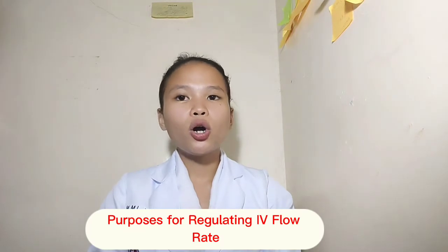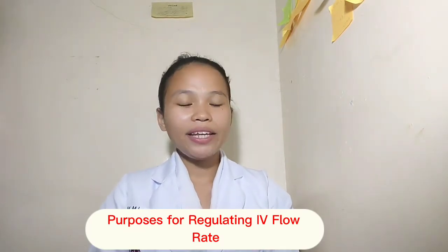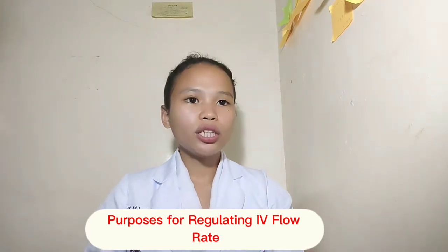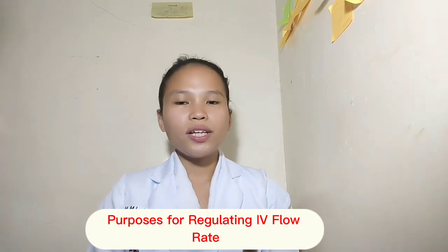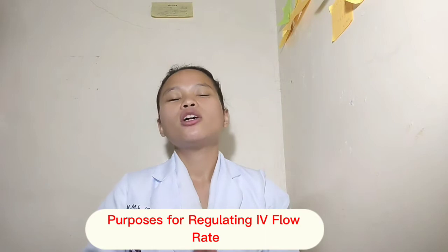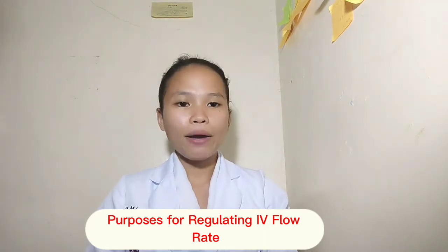First, comply with the prescribed rate ordered by the physician. Second, to maintain an equal and constant rate of fluid administration throughout the duration of infusion. Third, to assist in reassessing the progress of the fluid infusion. And lastly, to prevent circulatory overload or insufficient correction of hypovolemia. Step-by-step process of the procedure.